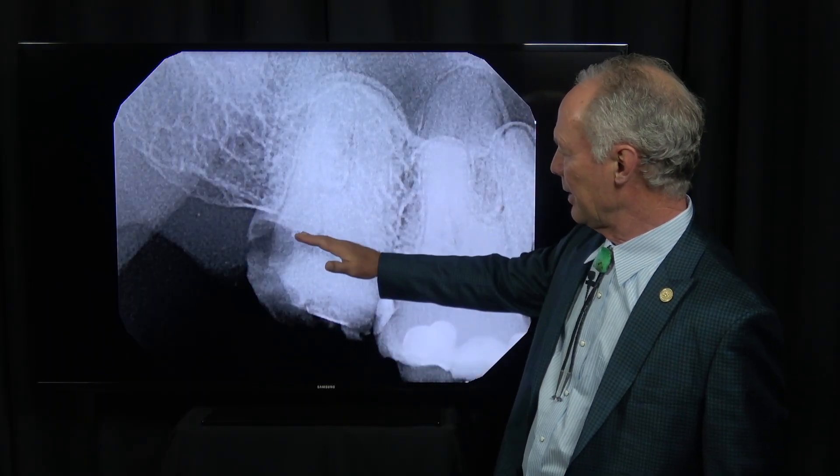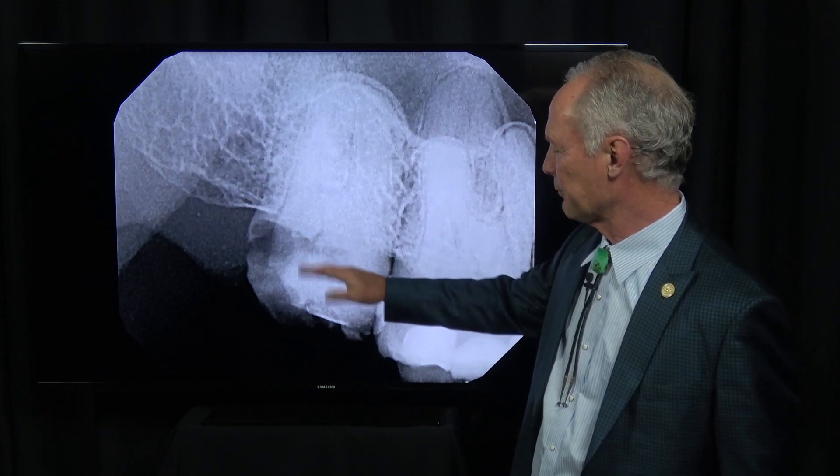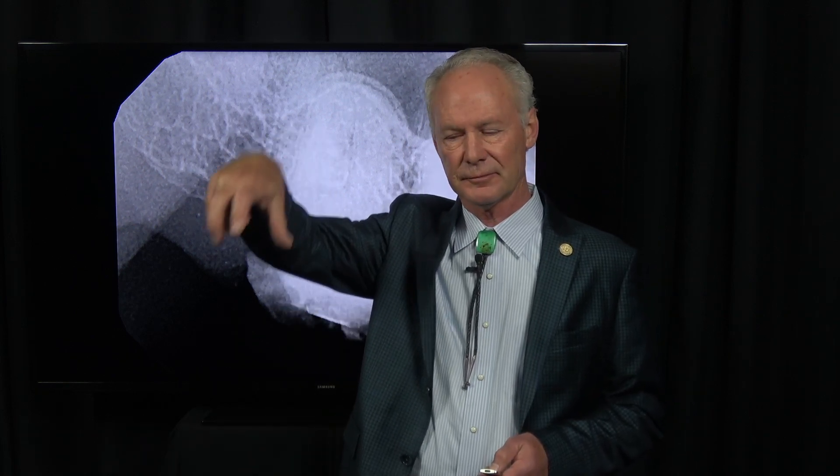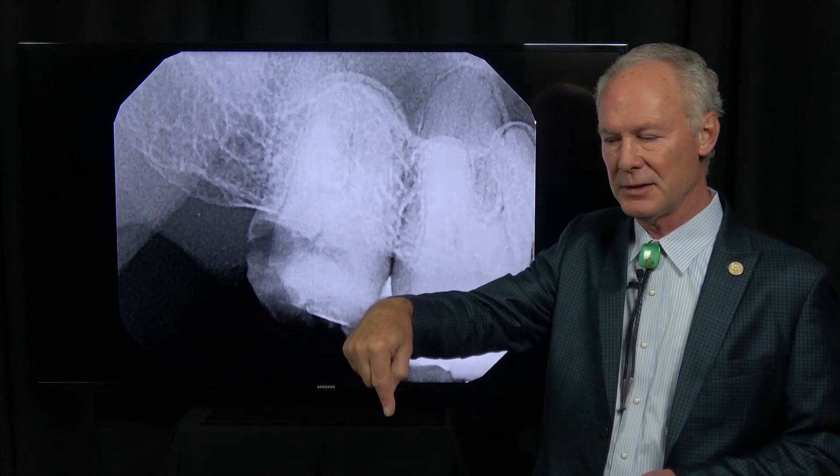But the patient wanted to graft it and just have the option of an implant if he wanted it. So when I do graft the socket — any socket of a molar tooth — I let the graft heal for six months prior to placing the implant. You've got three to four roots, so you can't place the implant at the time of extraction ideally.